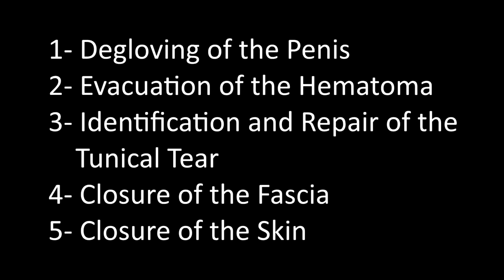So in this video, in summary, we introduced the steps: the degloving of the penis, evacuation of the hematoma, identification and repair of the tunical tear, and finally closure of the fascia and the skin.